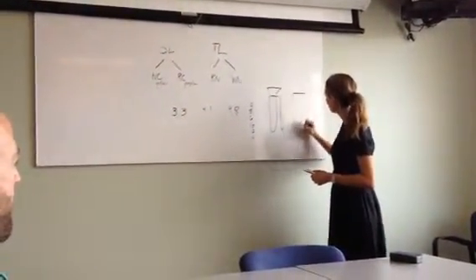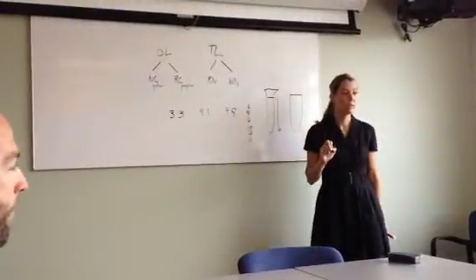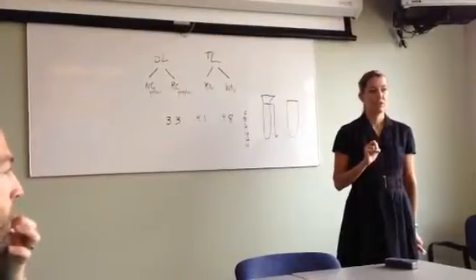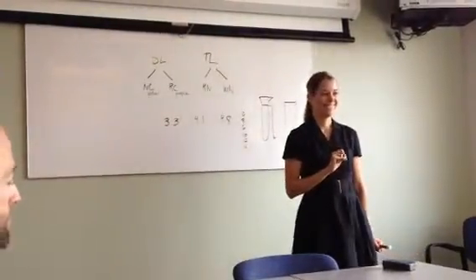Bone level implants. Can you just also review again, when are we going to want to order the standard? Or are we almost always just going to want to order standard plus? You are never going to want to order a standard. Okay.